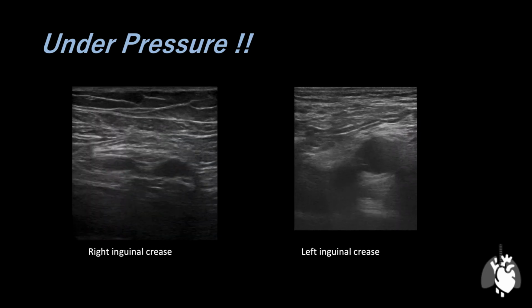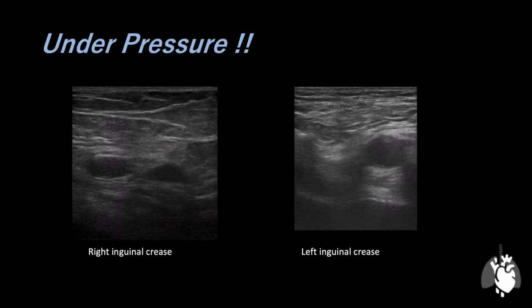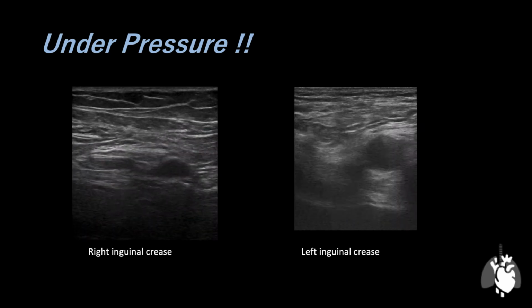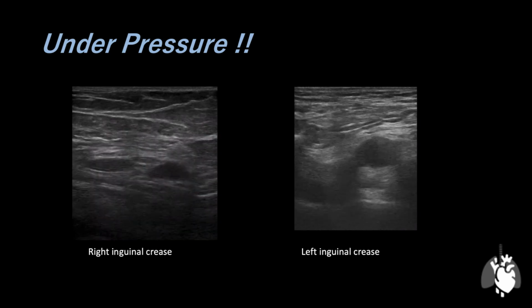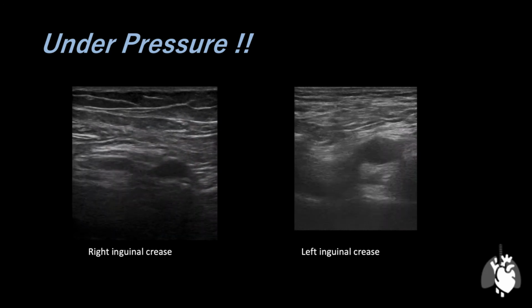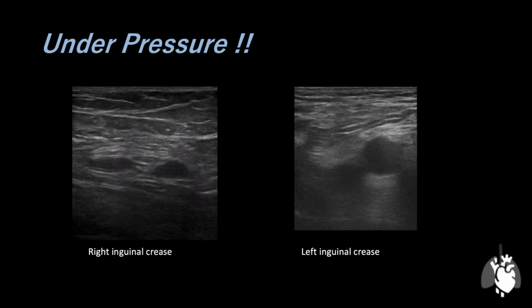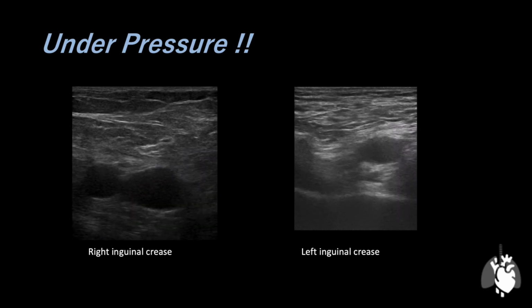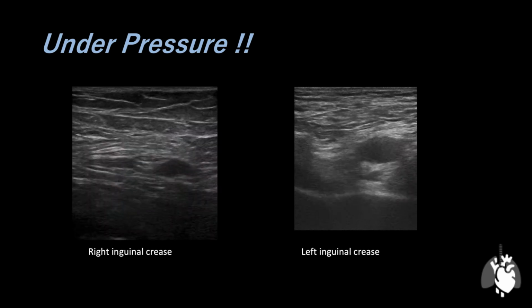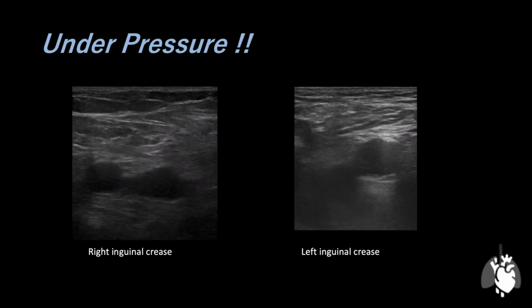The left image is of a patient's right inguinal vascular bundle. The lateral vessel is pulsatile and quite resistant to collapse with compression. It is a high-pressure vessel, so an artery. The medial vessel starts collapsing with much less pressure, but does not compress completely. It contains an acute hypoechoic thrombus. This would be a positive exam for DVT.